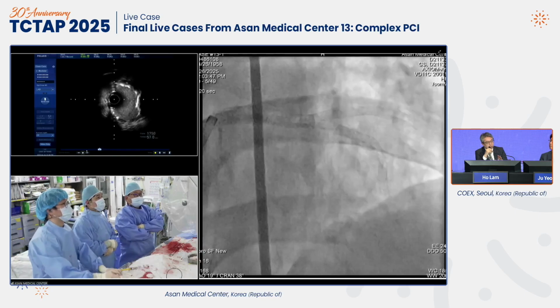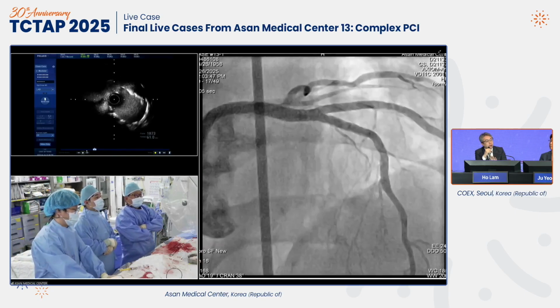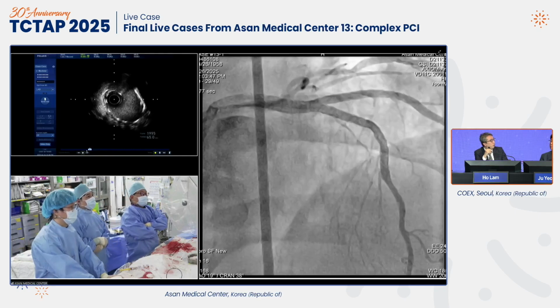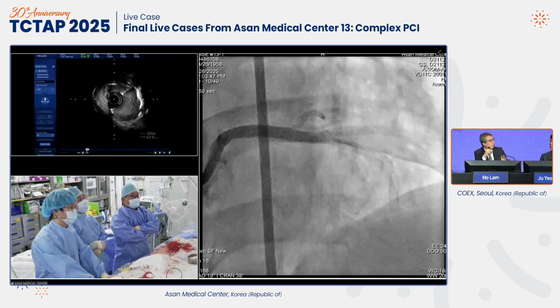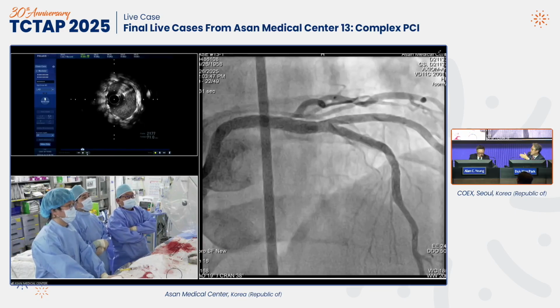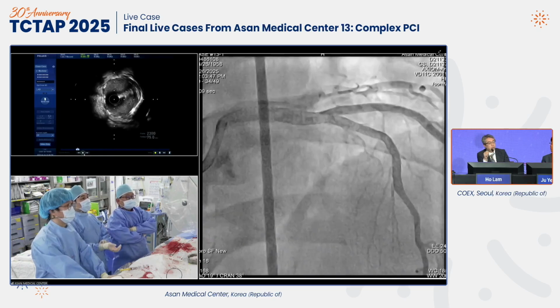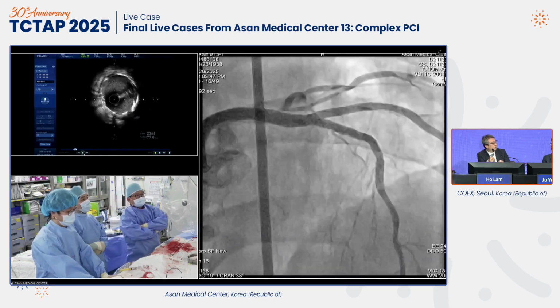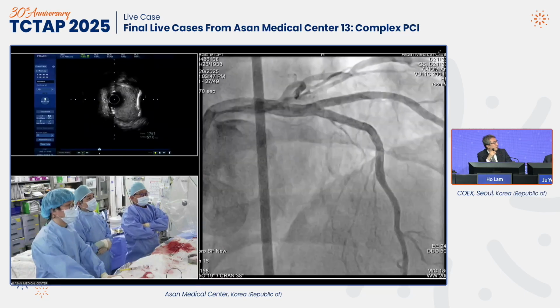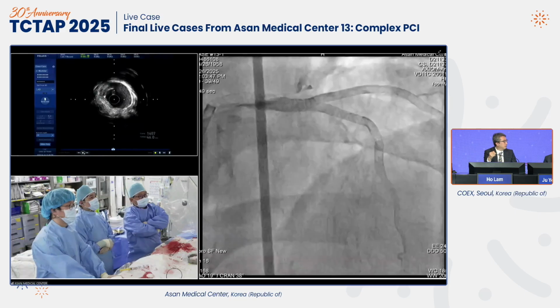We had some cases of post-stent IVL. In all cases, no ISR so far, touch wood. You can achieve a larger lumen with post-stenting shockwave. In one case, one shockwave catheter did not expand it, so we used another two shockwave catheters, finished 16 cycles, and then it expanded. But we found the efficacy and response is by luck.